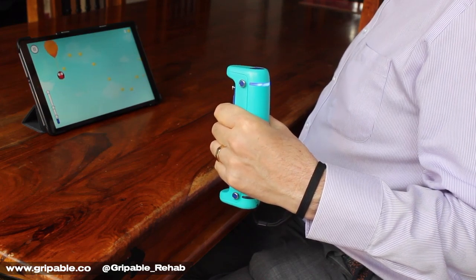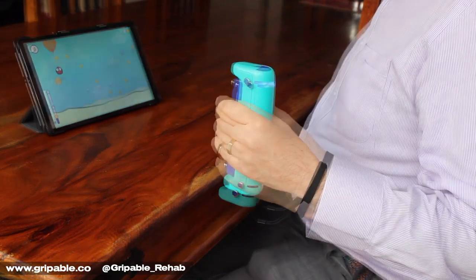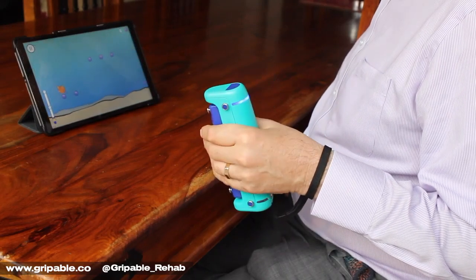For example, Balloon Buddies encourages controlled grip and release, whilst Pufferfish works on a full range of radial ulnar deviation.